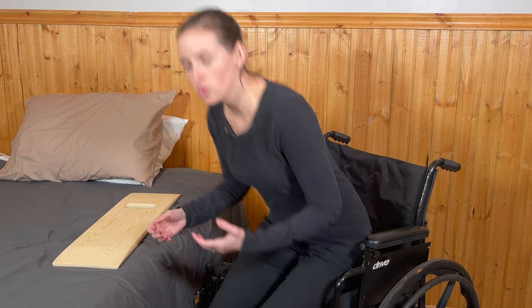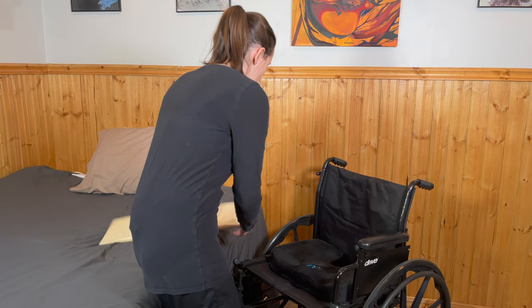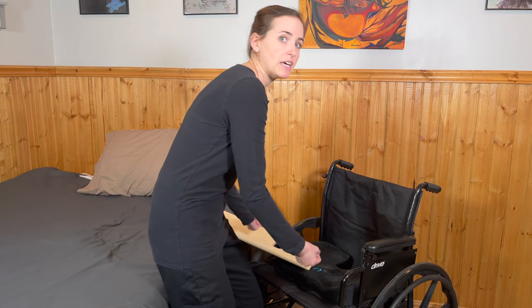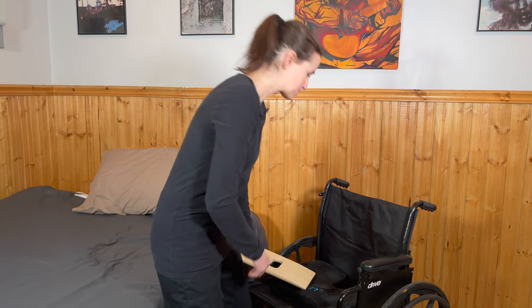If you're going to require caregiver assistance, traditionally the caregiver stands in front of you. They'll help with insertion of the slideboard underneath your bottom — instructing you to lean, sliding the board into position — then assist you using a gait belt or other appropriate attire, helping with the sliding motion up into bed. This is a very useful transfer for folks recovering from a lower body or pelvic injury, or for somebody who simply will not have the use of their lower body for the rest of their life.